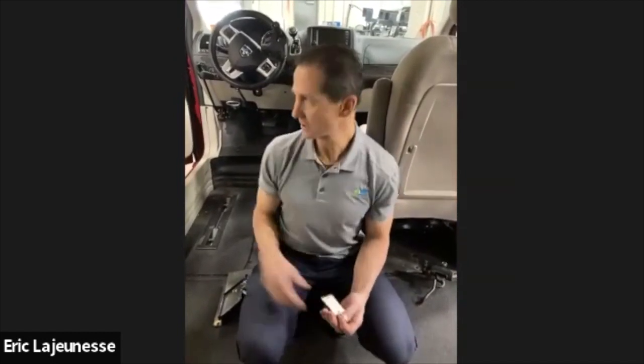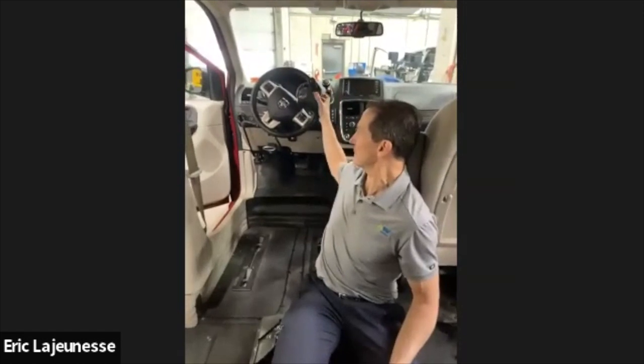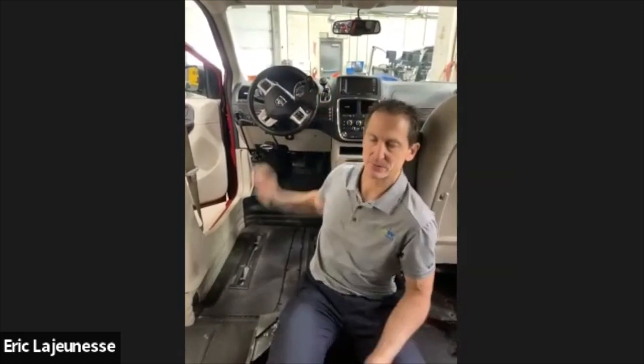We were the North American dealer for Guidosimplex. They're a big company in Italy that did the same as Kempf. We've shipped vehicles down there for Kempf systems. It's basically a gas ring that goes around, and then you have a lever for the brake.